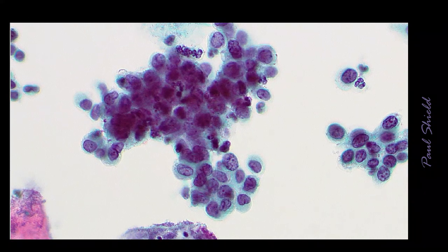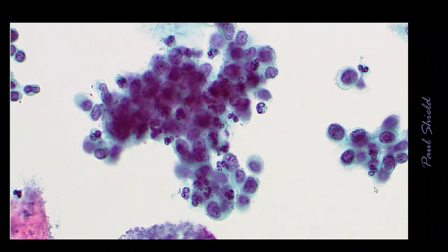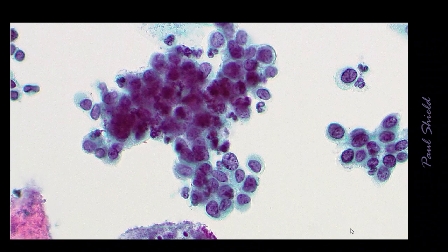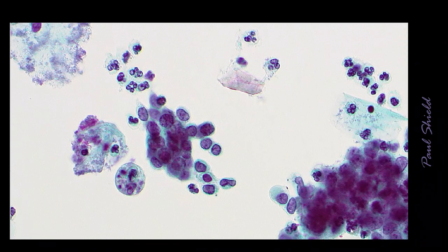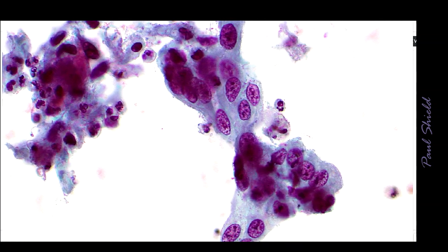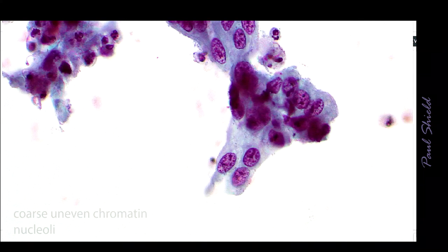There's a few features that suggest invasion possibly to me. One is these nuclei, like that one over there, they have very coarse, irregular distribution of the chromatin, and that is a feature of malignancy that we've talked about before. Just looking around, you can see there's some very high NC ratios here, and cells that would look like high SIL, and they actually predominate really. There's very few normal cells.